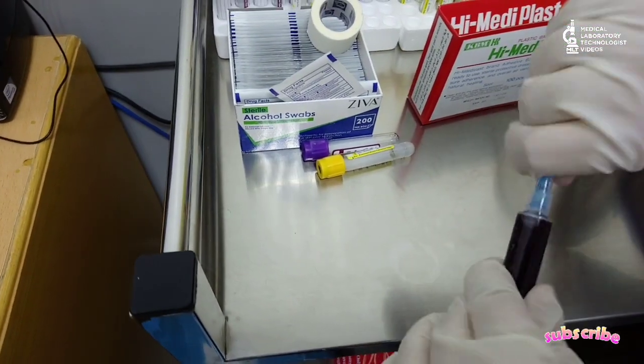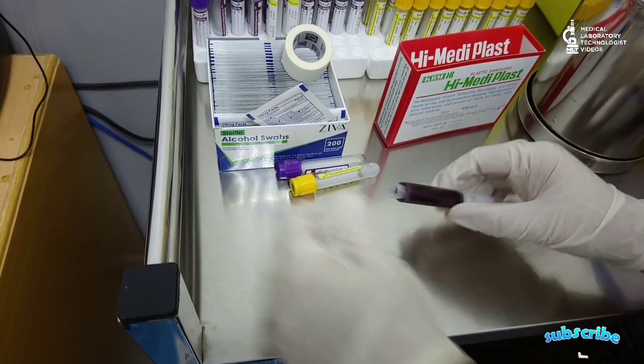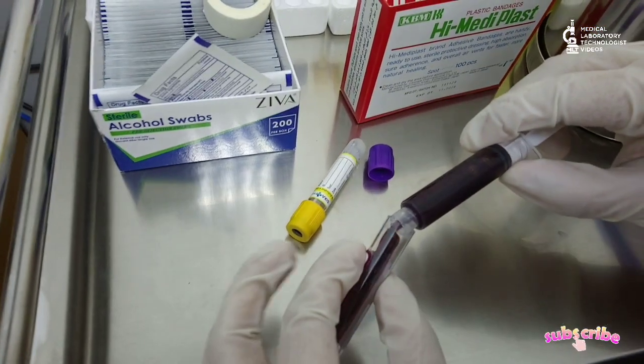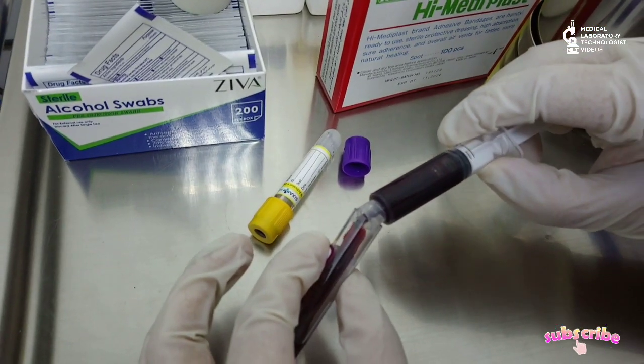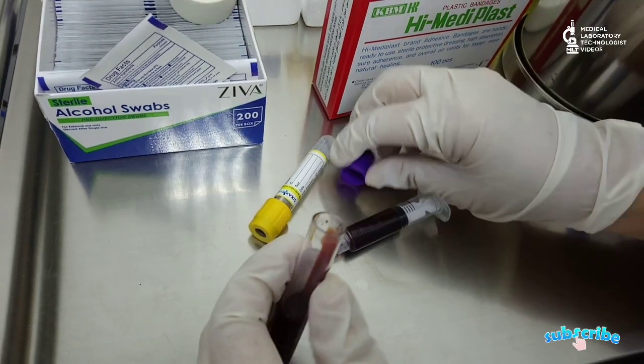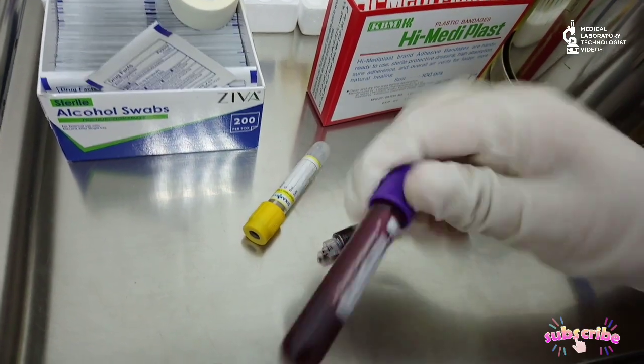Once you confirm that the bleeding has stopped, apply the spot bandage to avoid any contamination, and discard the used materials in the infectious waste bin. Then remove the needle with its cover and discard in the sharp container.